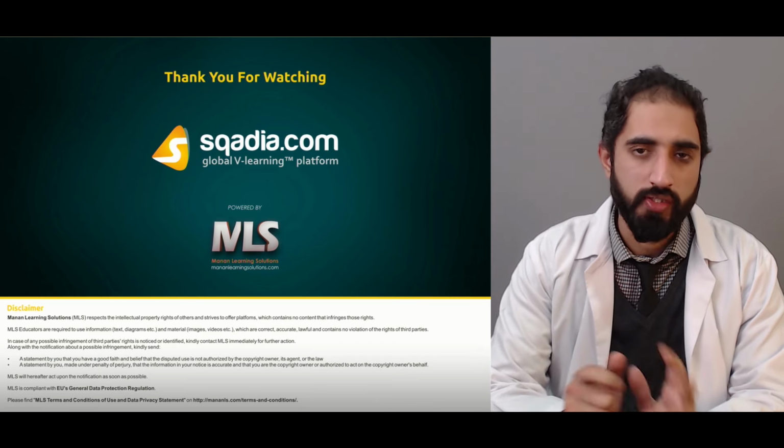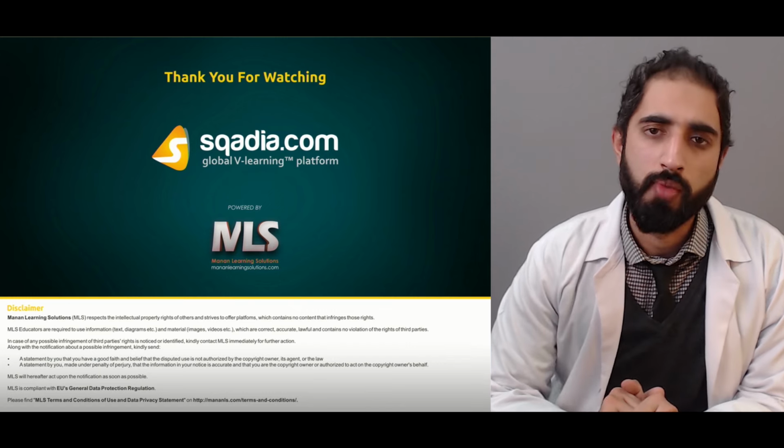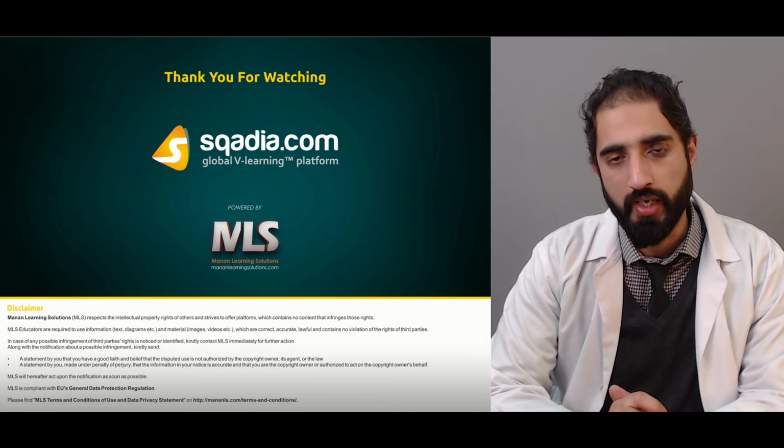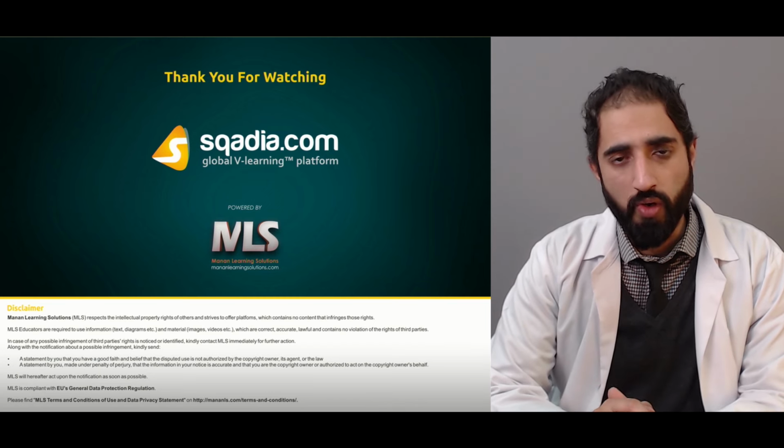So that was all about the cervical spine and the different types of imaging techniques or scans or the views that we use in the cervical spine and their indications. I hope you learned something new out of it.